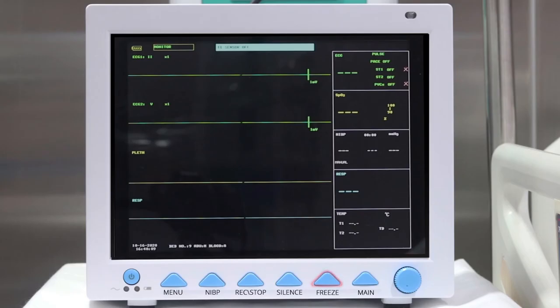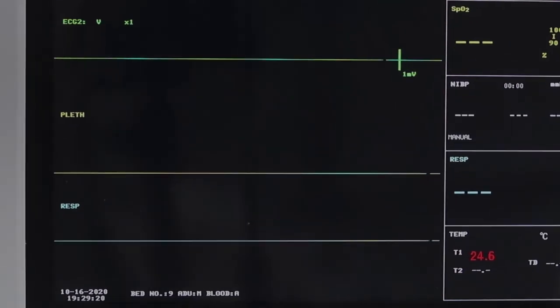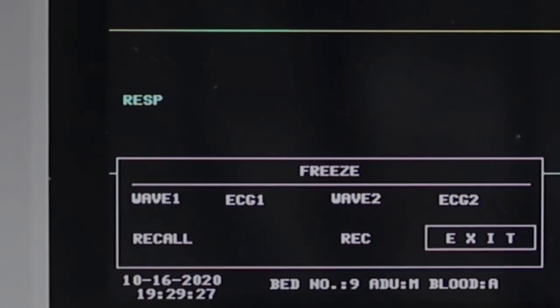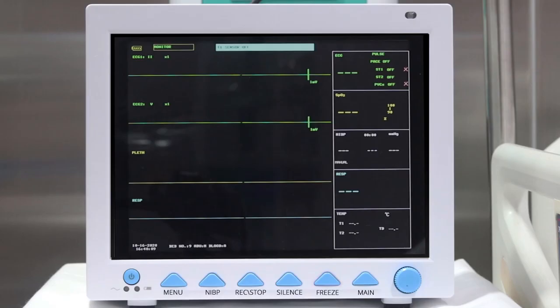Freeze: Press this button and the system will access the freeze status. In this status, the user may review the waveform of 34 seconds. Also, the frozen waveform can be printed out. In the freeze status, press this button again to discharge from the freeze status.